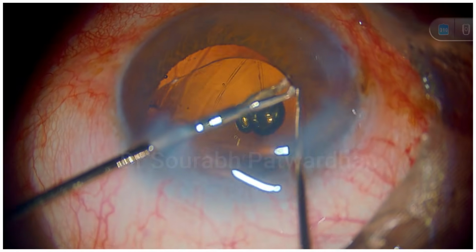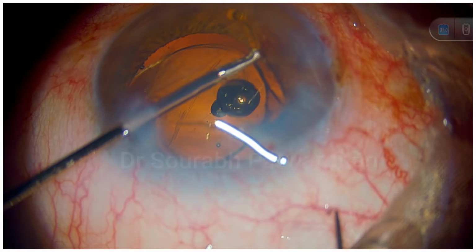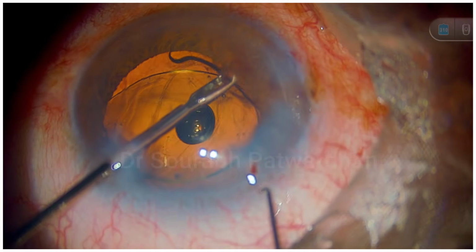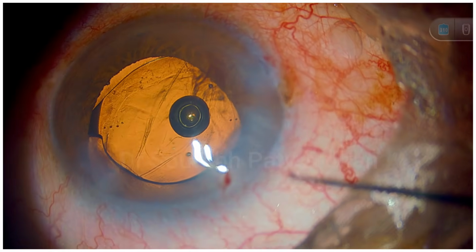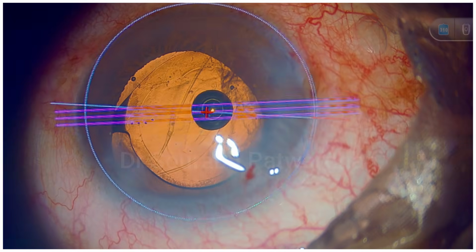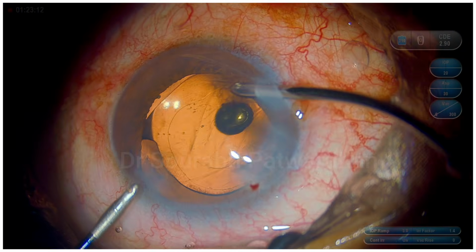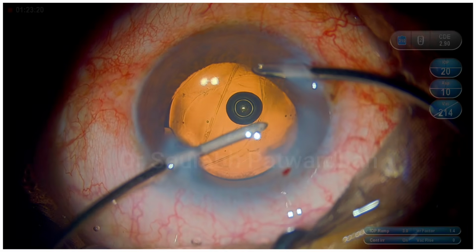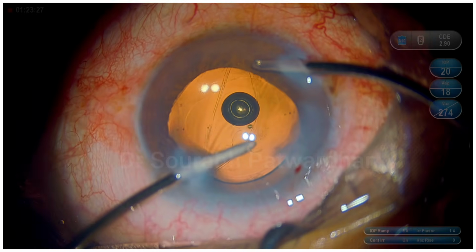Now the other method is to use forceps. So on the other side I am going to use a micro grasper or micro forceps to hold the haptic and then gently nudge it into the bag. So in these cases, avoid the usual dialing method of IOL placement in the bag. You have to just pull the haptic towards the center and then gently nudge it into the bag. Once this is done, you can see the IOL is well secure in the bag, and fortunately here the posterior capsular rupture was perpendicular to the placement of the IOL.